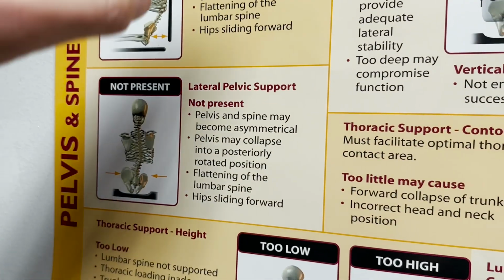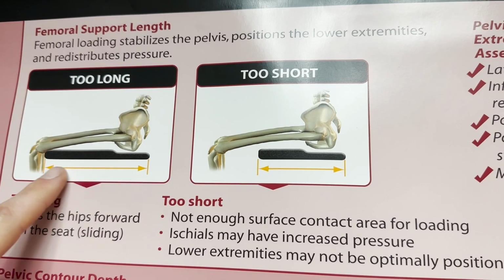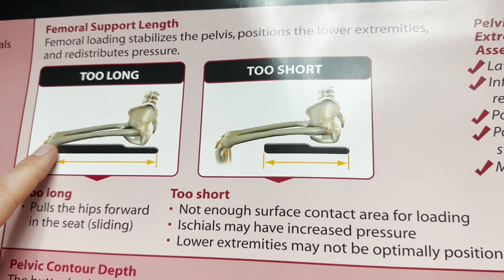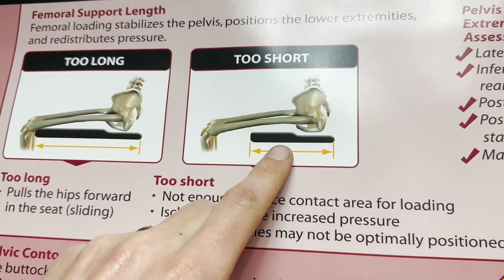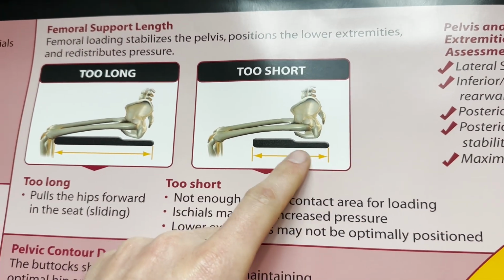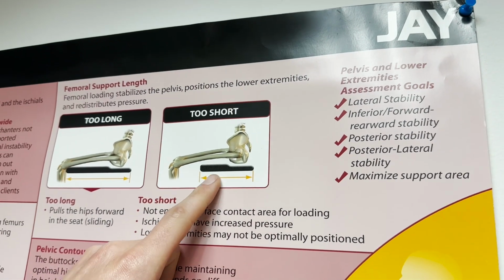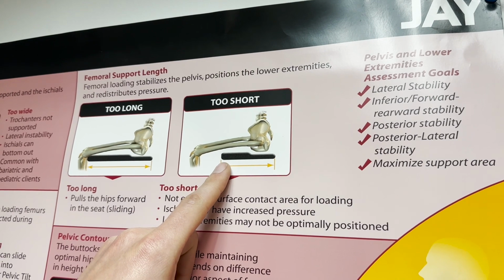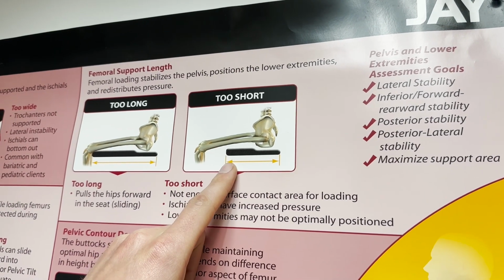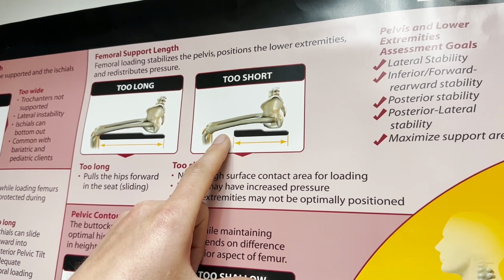Okay. Couple different things here, but I'll hit mostly on this one as the last point. If you make the seat depth too long, shoving on the back of the feet, there'll be that gap that develops that we just talked about. If we make it too short, we aren't actually changing anything on the person's anatomy, but we're not going to be capturing as much area as we could. And since pressure is force over area, if we capture a smaller amount of area, then the pressure is just going to go up overall. So we want to try and capture as much area as we can.